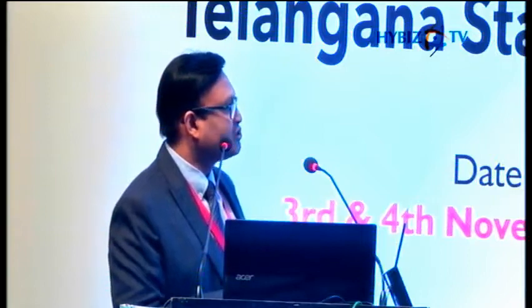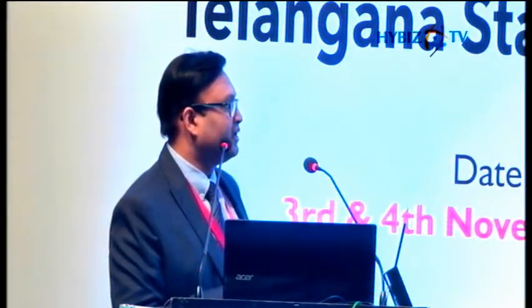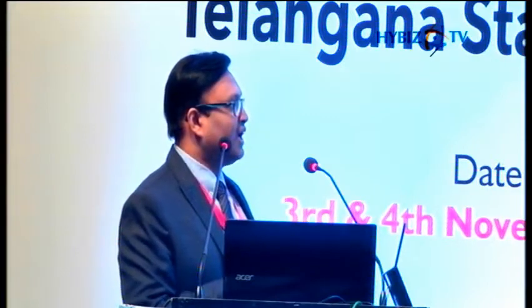Similarly for the LA, it should not be an M mode cut. As far as possible, direct measurements from leading edge to leading edge should be done. Normally it should not be inner edge to inner edge, as we commonly do. It should be from leading edge to leading edge. And for the LVOT, a zoom mode is more commonly used to measure the LVOT annulus or the ascending aorta.